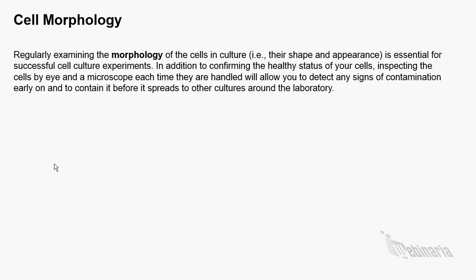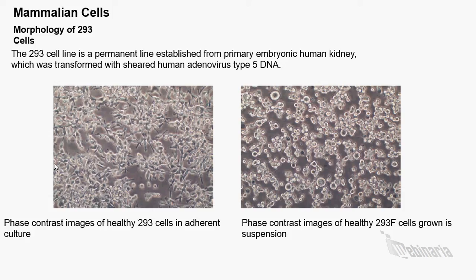Some signs of deterioration may be caused by a variety of reasons, including contamination of the culture, senescence of the cell lines, or the presence of any toxic compounds in the media.